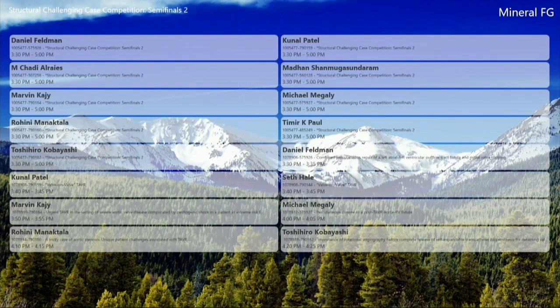If you follow the strategy of removing the valve when you recognize it's having an infolding issue and bringing a new valve, you may have wide open AI while doing that, because you may have caused mechanical valvuloplasty when you partially opened the quote-unquote defective valve. So there are so many logistical nightmare scenarios in this problem that, number one, we need to speak with the vendor about this, but number two, it makes it even less appealing if this is truly more common than we think.